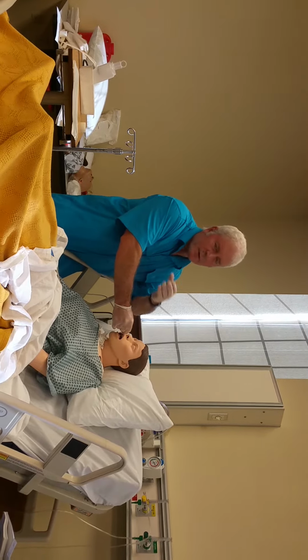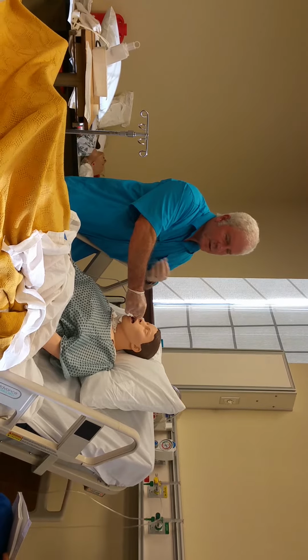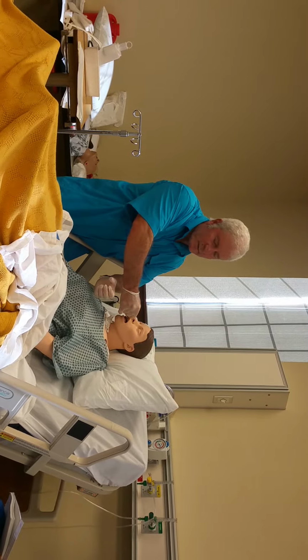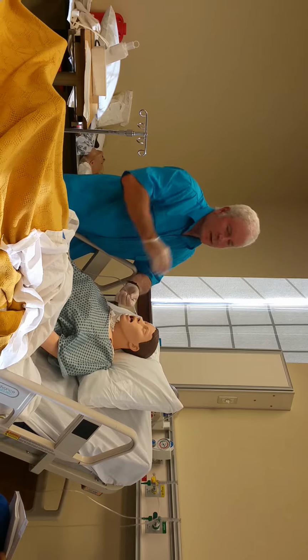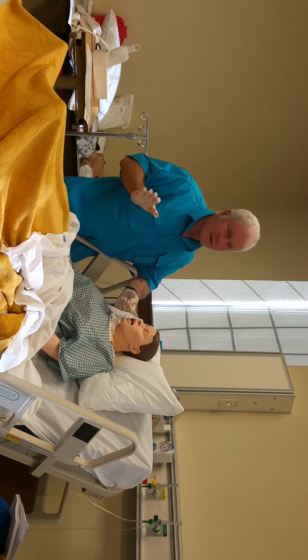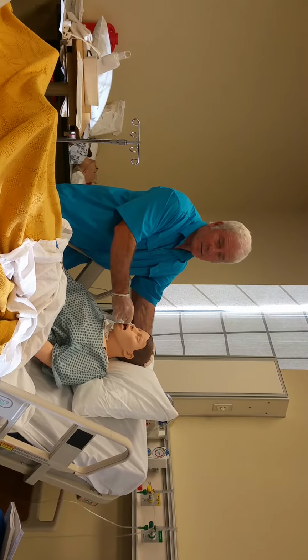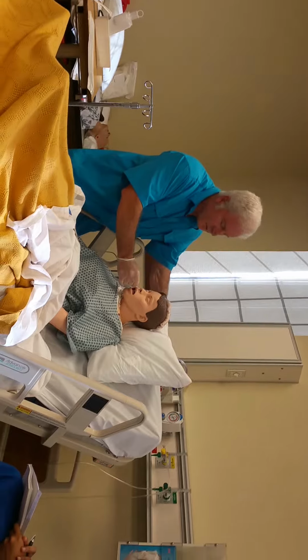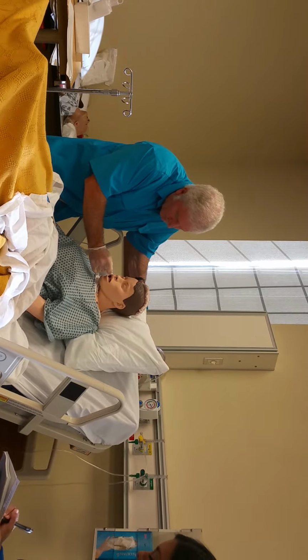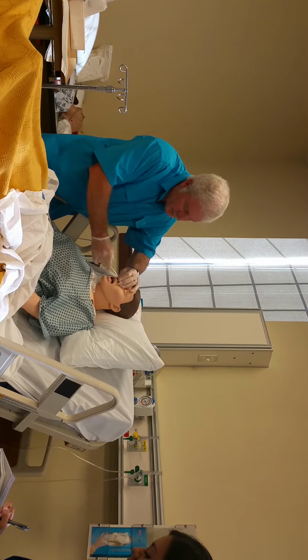Now again, remember, you can use the cup of water. The book shows using a cup of water with a straw. You having them hold that cup of water and take a sip, and then when they swallow, you advance. I never use a cup of water, but if that's what you want to do, it's fine. I'm not going to require it for the checkoff. I just say, okay, what I need for you to do is swallow for me. He's going to swallow, and when he swallows, I'm going to push, and then I'm just going to hold it.